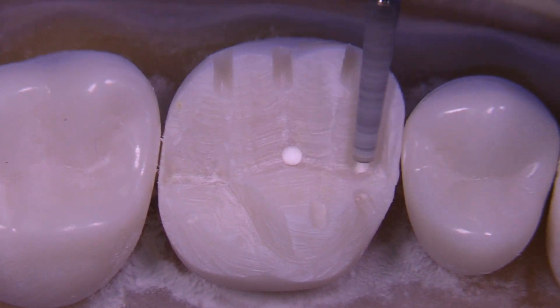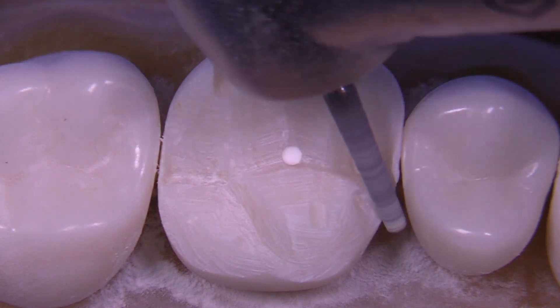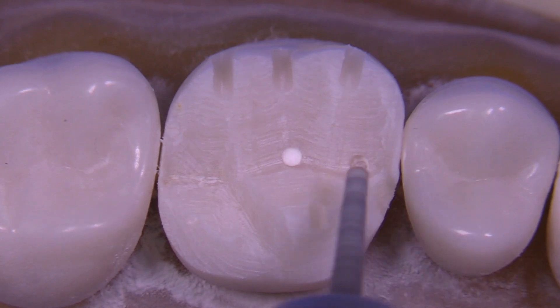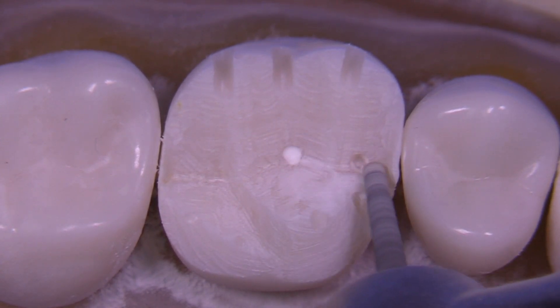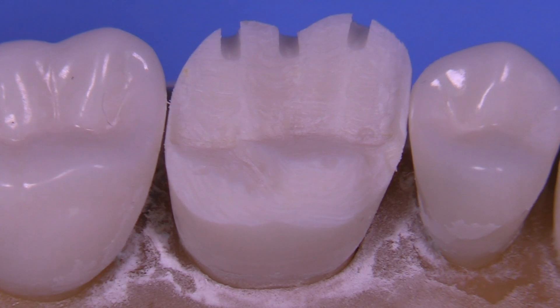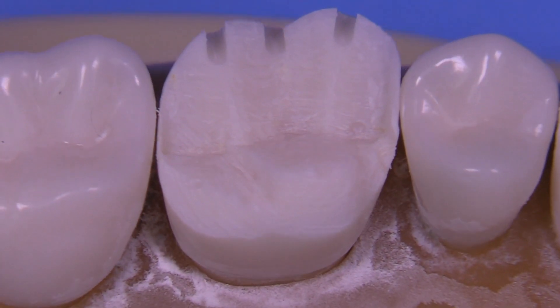I've sped this up a little bit so we can get through the video more efficiently. But you notice that these depth cuts — so we know we're for sure 1.5 millimeters, undeniably correct in our measurements — are continuing to remind us of areas where we need to reduce more.